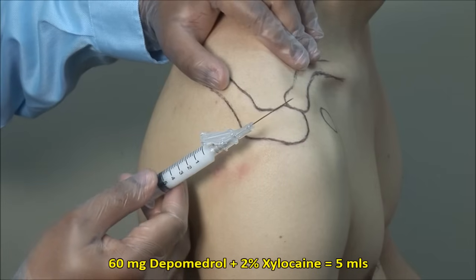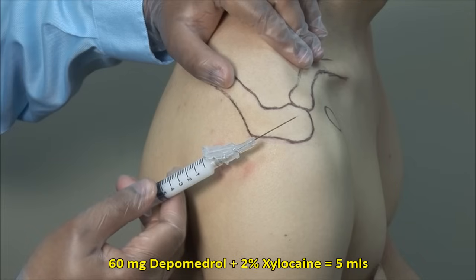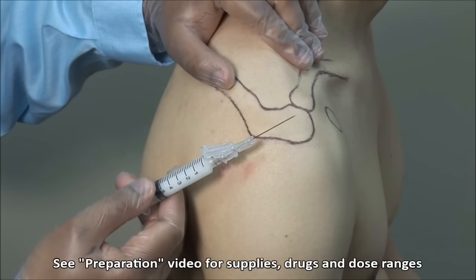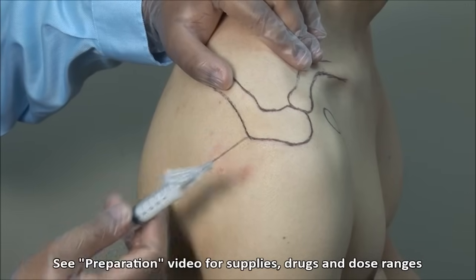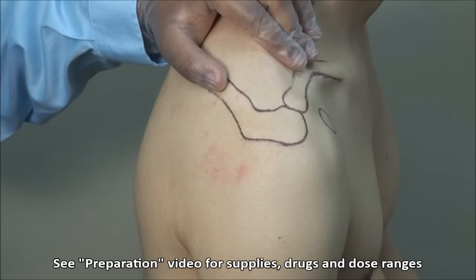Here I have a mixture of 60 mg of depomedrol mixed with 2% xylocaine to a volume of 5 mLs, and I am using a 22 gauge 1.5 inch needle with the bevel facing upwards. You can also use up to a total volume of 10 mLs.